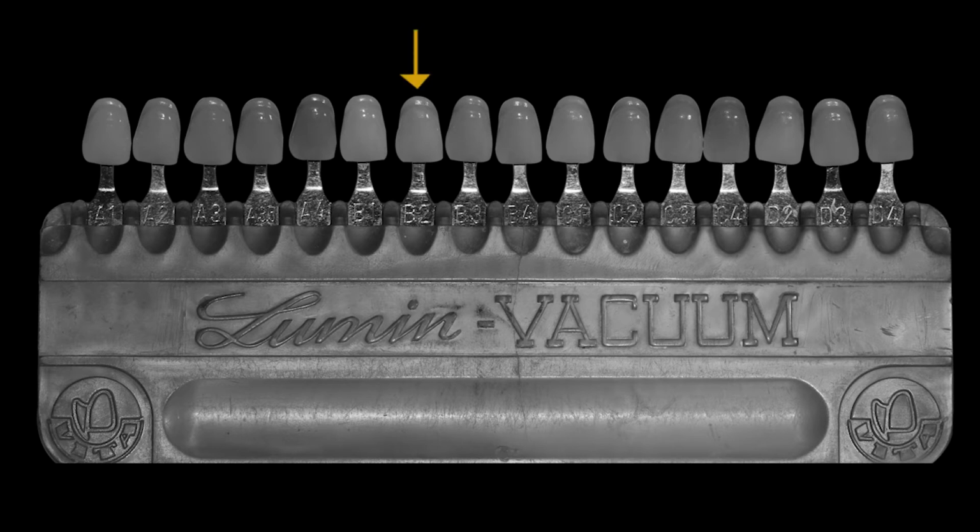Then B2 goes darker. My concept here is that there's no rhyme or reason to how this shade guide was oriented. They were random colors picked. So how you choose or use this tool on picking a shade is a little bit more difficult unless you're just randomly trying to pick the color that best matches.